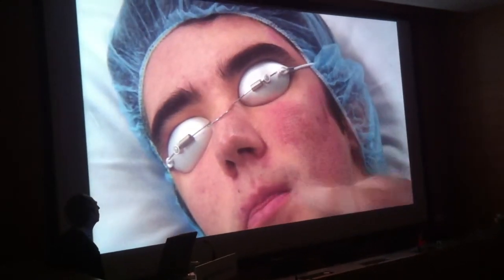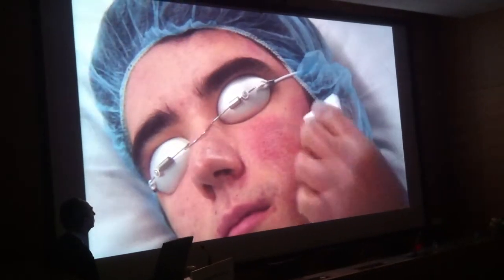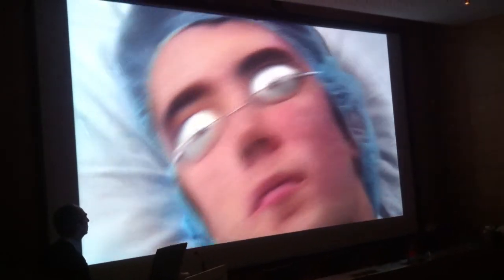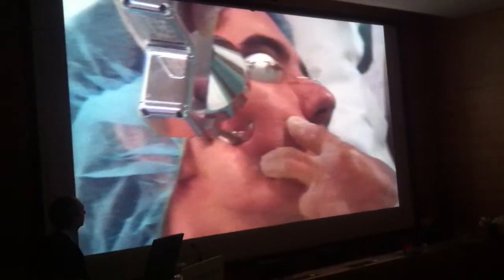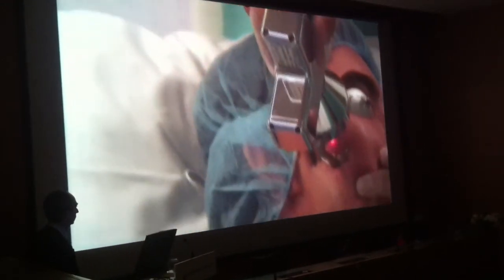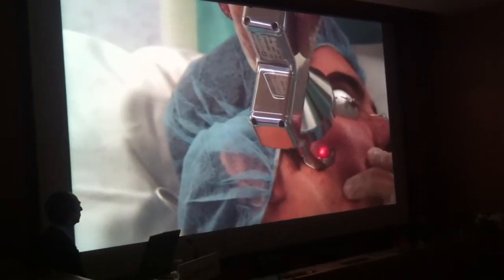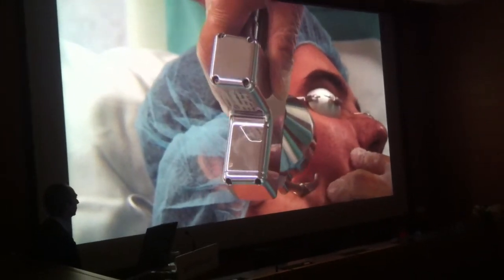As you see also, it didn't take long, thanks to the power of the machine, to complete one cheek. And now I can go and complete the other cheek quite fast. And then at the end, I will just feather the other areas. I've already warned this young guy, Bruno, our patient, that he can stop me at any minute if it becomes unbearable. But as you see, he's barely blinking.